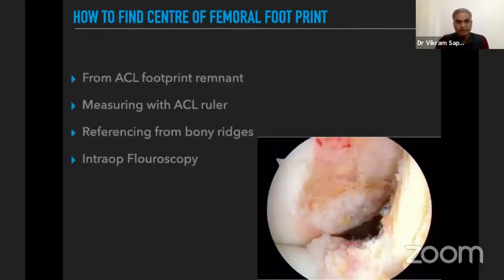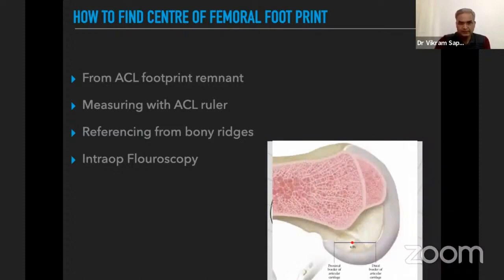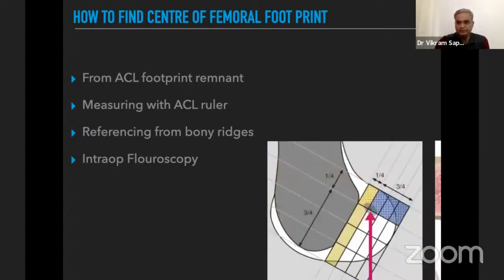To find the center of the femoral footprint: in acute and subacute cases, you can visualize the ACL femoral footprint remnant and target its center. You can also measure with an ACL ruler, reference from bony ridges — the lateral intercondylar ridge and bifurcate ridge — use intraoperative fluoroscopy, or use the quadrant method.